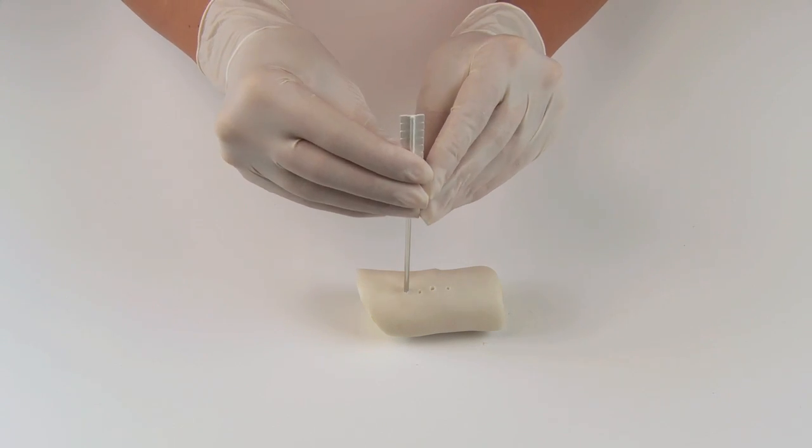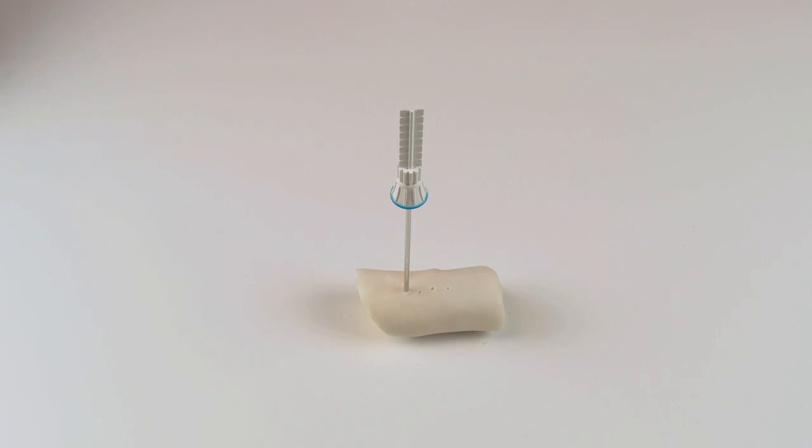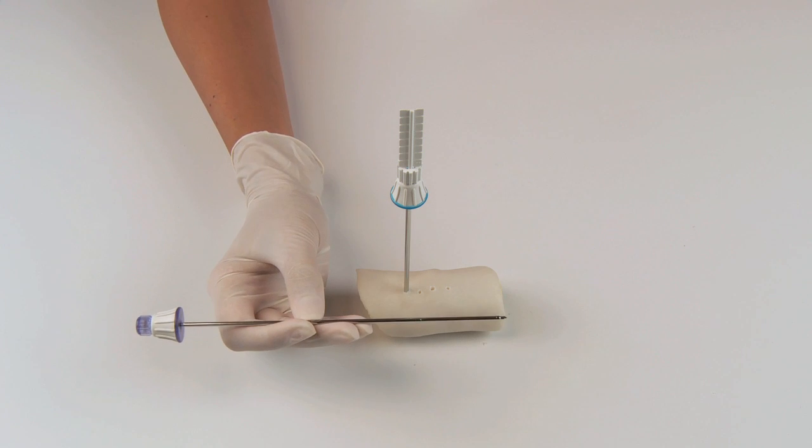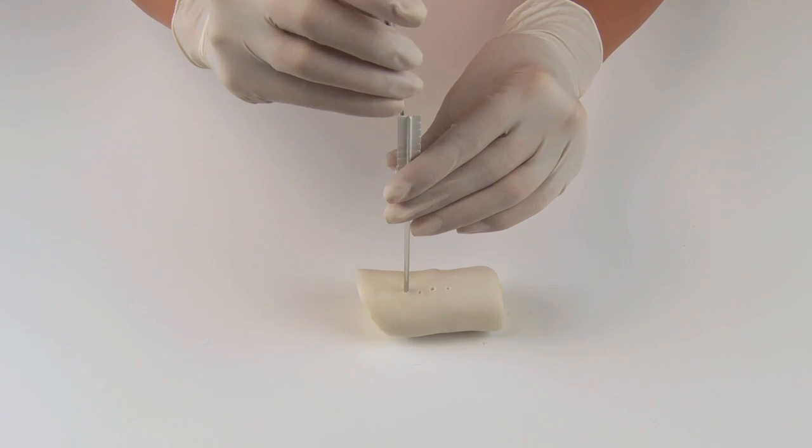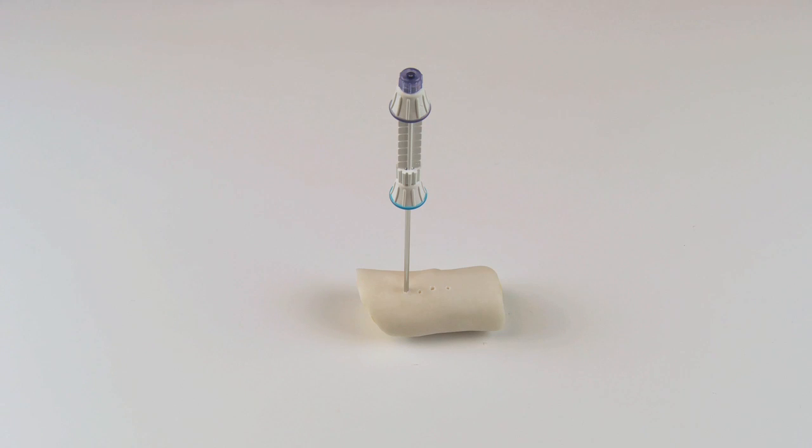Click the depth gauge onto the top of the penetration cannula hub. Insert the biopsy needle. The tip of the biopsy needle will then align with the tip of the penetration cannula.